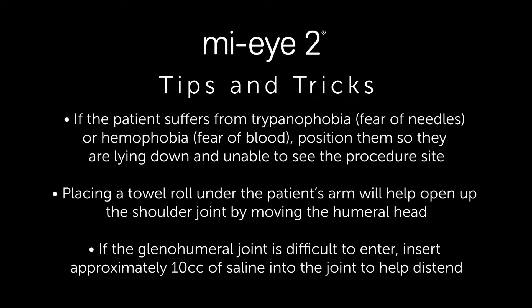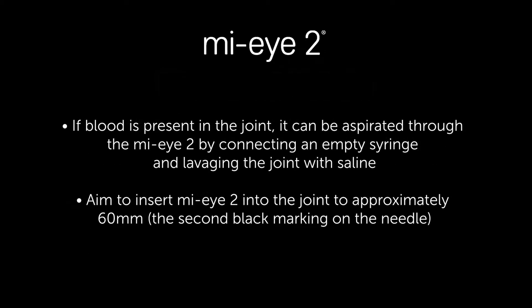If the glenohumeral joint is extremely tight, you may also choose to use a spinal needle to inject about 10 cc's of saline into the joint. If there is blood present within the joint, it can be aspirated through the MyEye by connecting an empty syringe and lavaging the joint with saline. It is important to remember to insert the MyEye to the appropriate depth, typically between 45 millimeters and 60 millimeters.